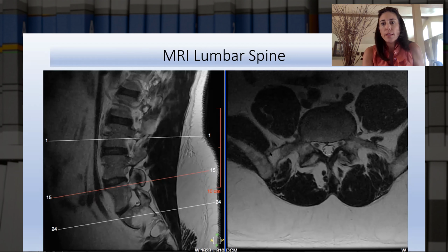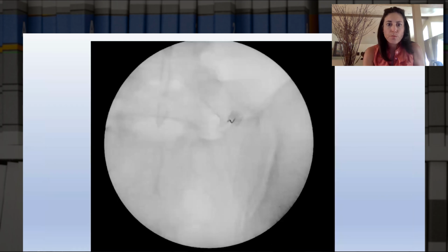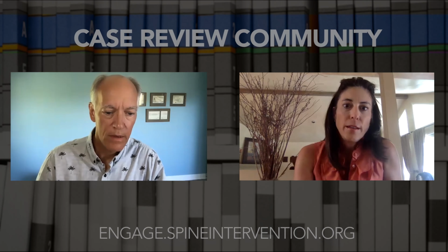You can see that the transverse process is extensively long on both sides. Over here on the right side, it wasn't well defined in terms of the bony articulation, and therefore a CT scan was ordered. I've just included a couple slices here, but you can see over here, especially in the axial views, that there is an articulation that looks like a false joint right here. This is his facet joint. And you can see on the far lateral, on the sagittal view, it looks like it's articulating with the top of the sacrum. Therefore, I brought him into the fluoro suite and placed him prone and did, as the surgeon requested, an injection into that false joint. Back to you, Tim.